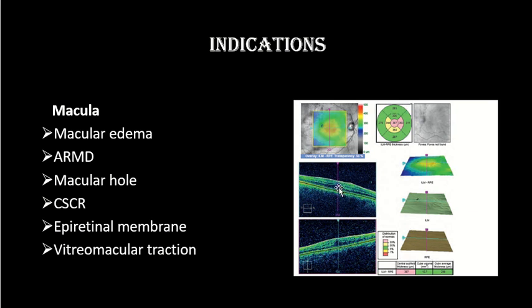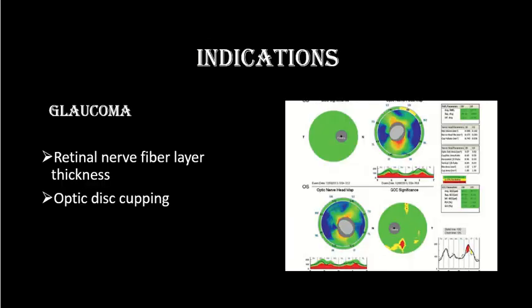Here on the OCT thickness map, we can see a red area corresponding to retinal edema of more than 480 microns, while normal macular thickness is about 250 microns. We can also see the OCT picture showing loss of foveal contour and edema within the retina. Numerical measurements of macular thickness are also provided in different zones. OCT is also done in cases of glaucoma.